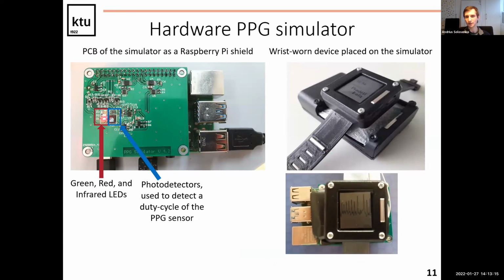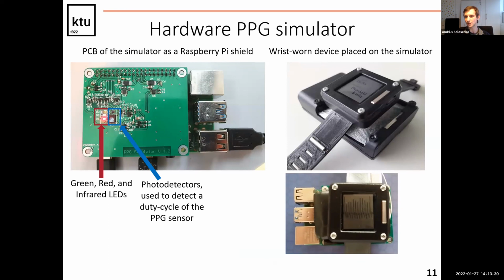And finally, our intent was to use that model in our hardware simulator, also for testing the atrial fibrillation detector in our wrist-worn device. Here you can see the prototype of our wrist-worn device and our simulator. So that simulator runs inside and generates signals which are recorded by the wrist-worn device, and it starts vibrating when it detects the arrhythmia.